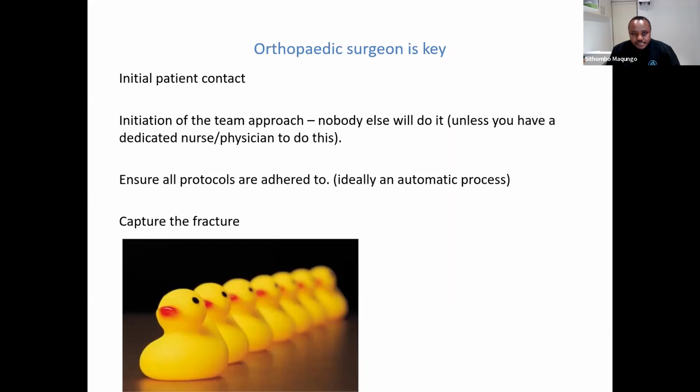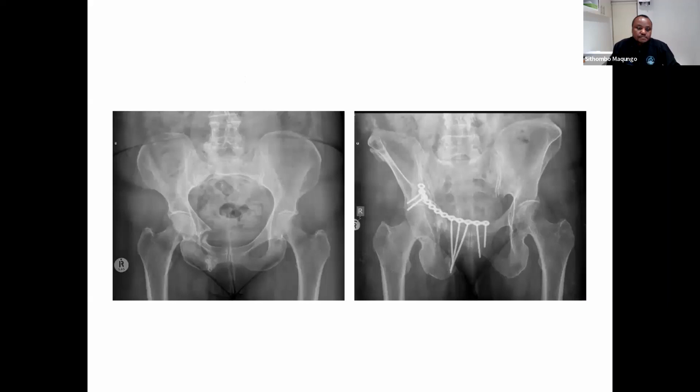So typically what we do for pelvis fragility fracture patients is stabilization and bone grafting. And this is the example that you see. On the left of your screen is an established non-union that has been treated with bone grafting and anterior pelvis plating. And we often take bone graft from the iliac wing. And you can see there was some bone graft left over. Here's some change there, but she's now united. So that's the approach, that once the non-union is established, you need rigid fixation and you need bone grafting to stimulate the biology.